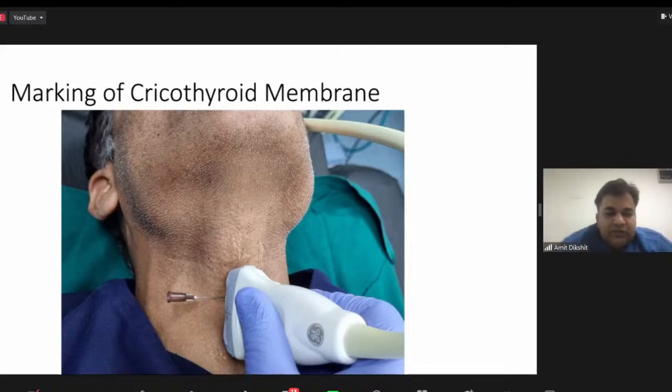So this is one school of thought, and this has been promoted, advocated, and popularized by Dr. Pankaj Kundra and team. For critically ill or high-risk patients, we do put a radial artery cannula, and at the end of surgery, we just remove that cannula, and the patients are safe. So in a difficult airway, why not only mark, but go one step ahead and just puncture it and place the cannula? Because in emergency, whenever there is trauma, it is very, very difficult to get any cannula.